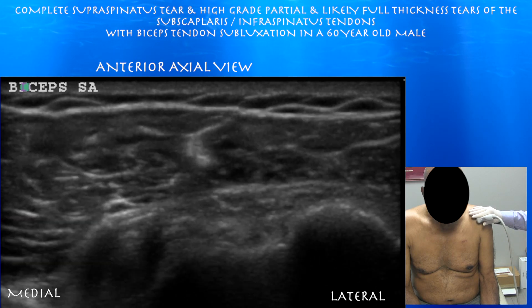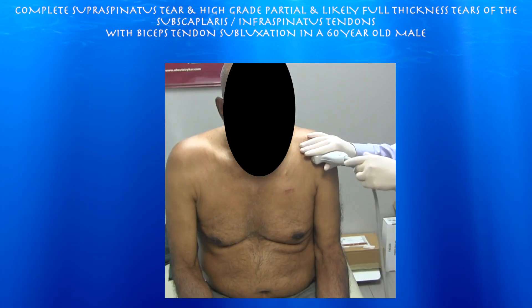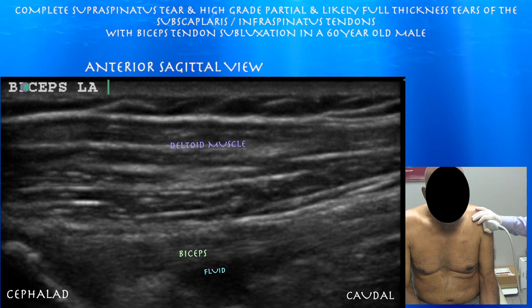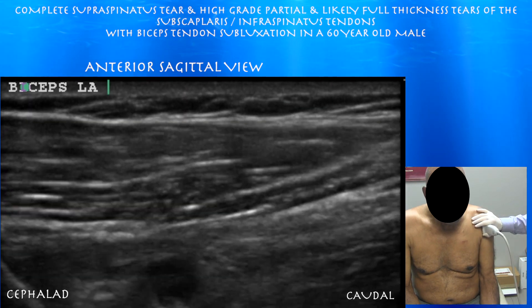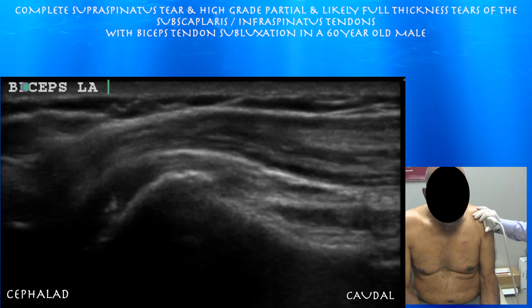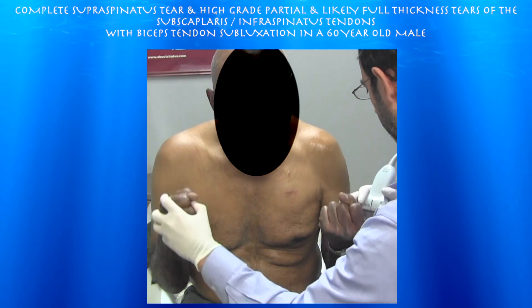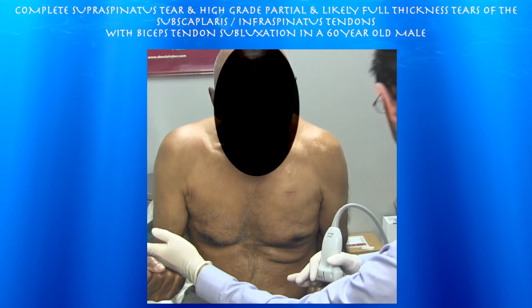Again here you see the biceps tendon and you can see the coracohumeral ligament. Here's that tissue compressed within the bicipital groove that looked like the biceps. Looking at it now in long axis — we're more medial than we would normally be, consistent with subluxation of the biceps tendon. You can appreciate the fibrillar texture. The biceps tendon is surrounded by fluid and I'm much more medial than I would expect. He doesn't show a Popeye sign — he just has subluxation of the biceps secondary to a tear of the subscapularis tendon.